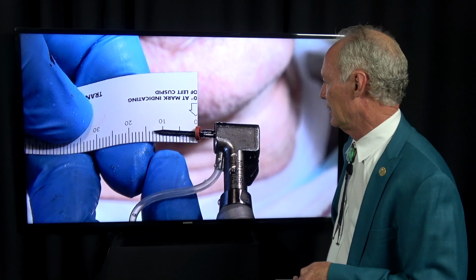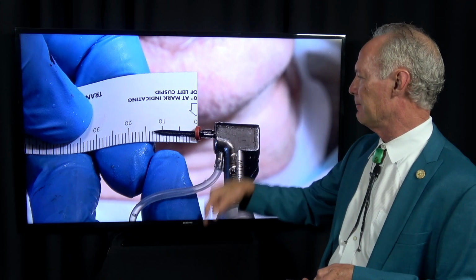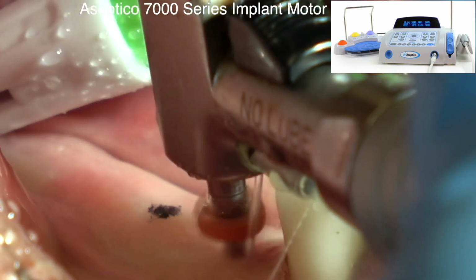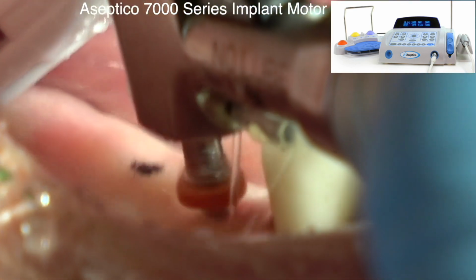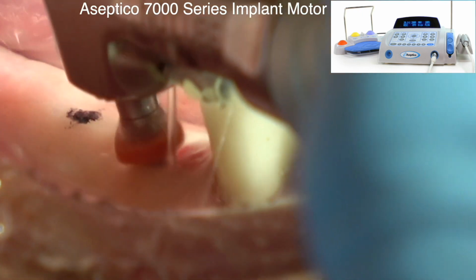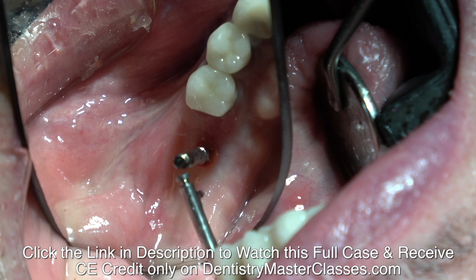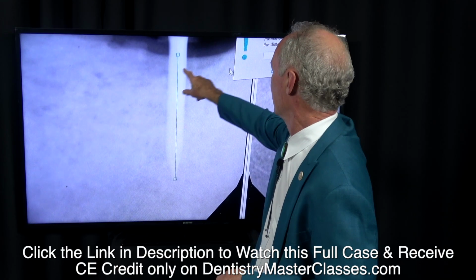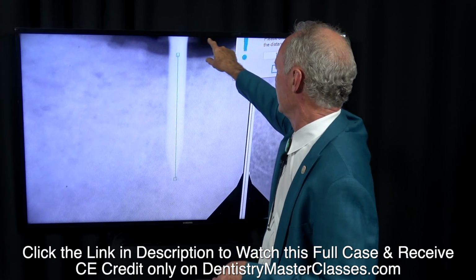I would like the osteotomy to be a little bit deeper than the implant, because that implant's not going to screw any deeper than the osteotomy depth. So I don't mind the osteotomy being a little bit deeper than the implant. So this is a little wider pilot drill, okay? So that's 12.1 tip to top of alveolar crest, and we've got 2 more millimeters up here.